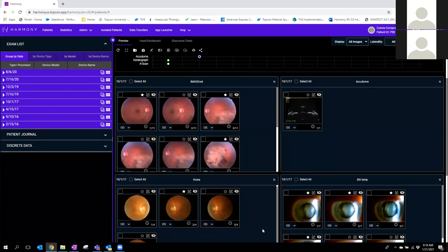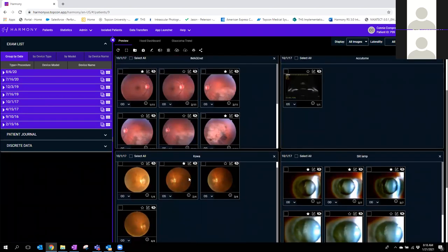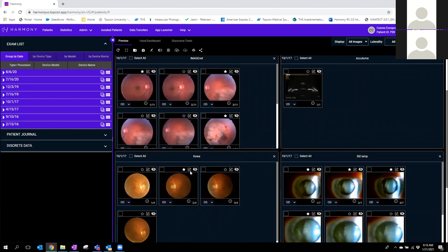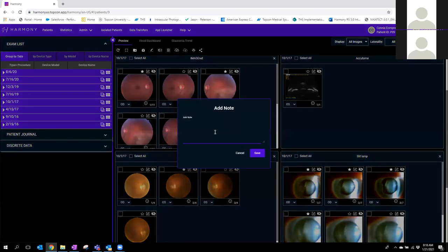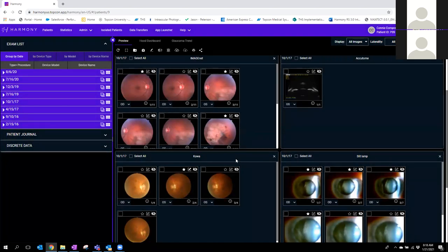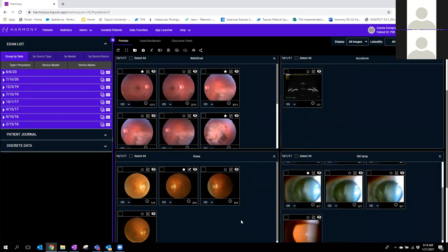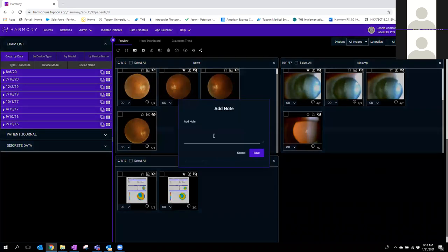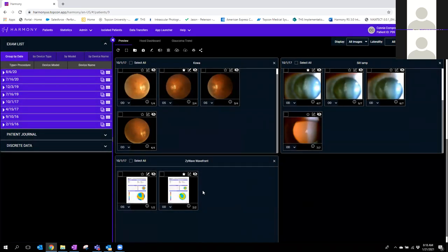Moving across the icons — there's a note icon. If there's something of interest you want to mark right away, you can type in a quick note and save it. Anytime you log a note or annotation, they all go to patient journal. You can leave a note in thumbnail view or in large view as well. Next, there's a hide icon — an eyeball with a strikethrough. Depending on your account, a provider's account may or may not have this ability. It's really up to your admin or IT on your side whether this gets turned on.